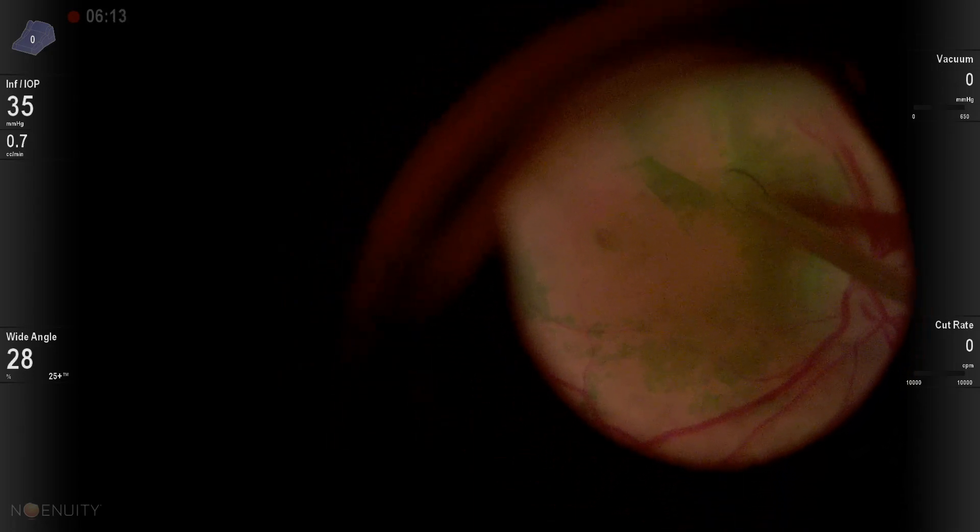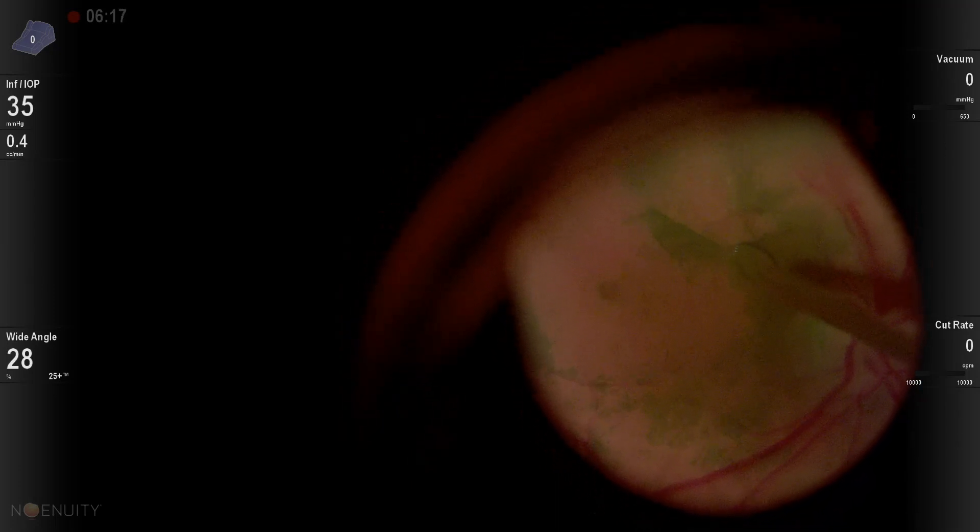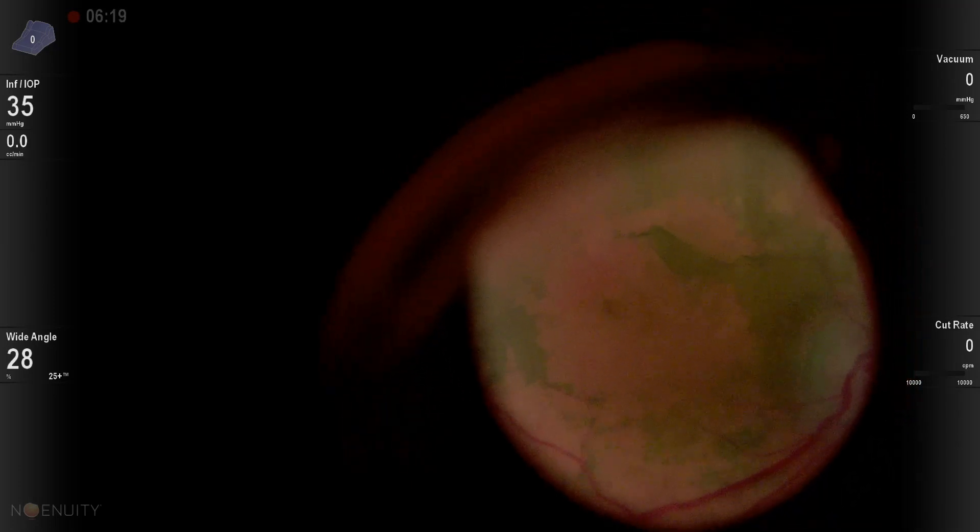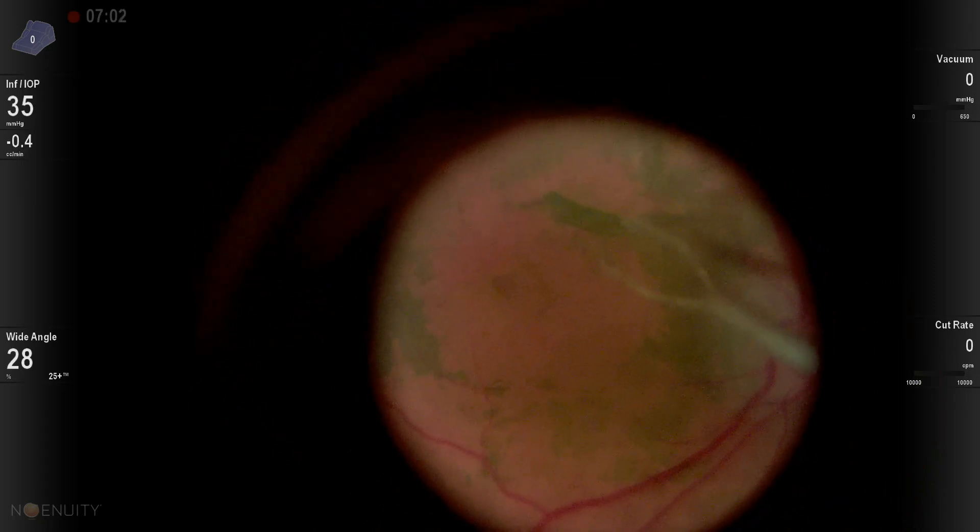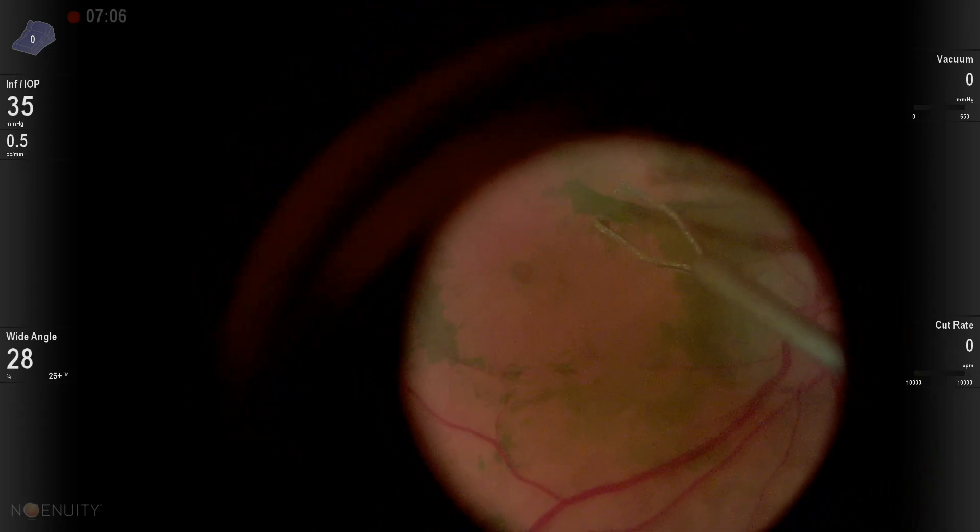Using this Flex Loop to create an edge that's elevated off the retina gives you added safety. You can see I can extend the Flex Loop or move it more in depending on how much stiffness I want.